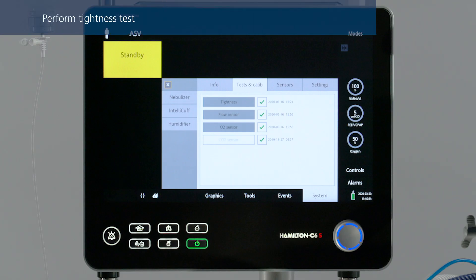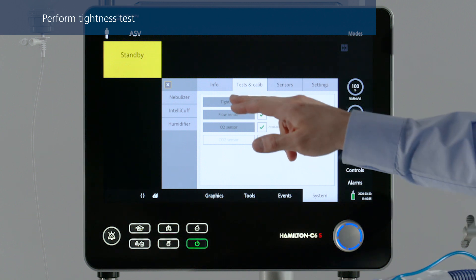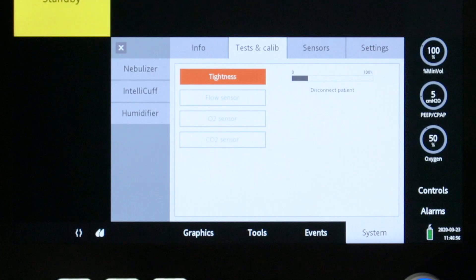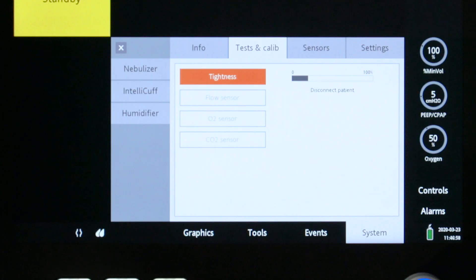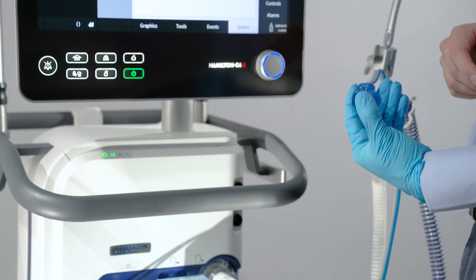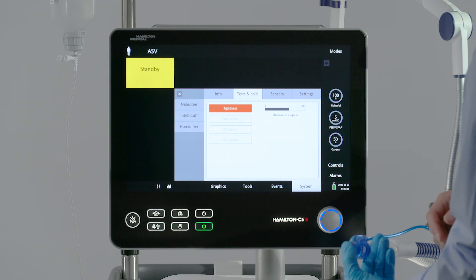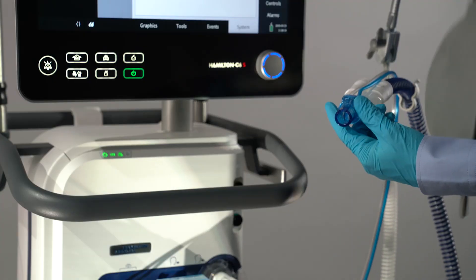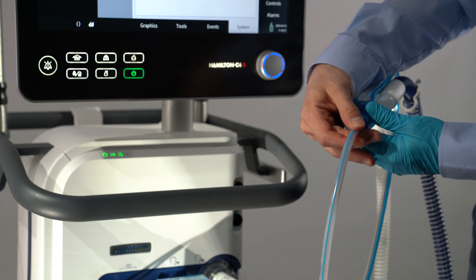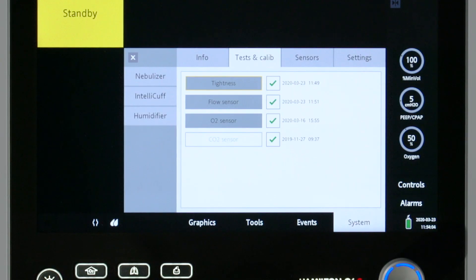The tightness test checks for leakage in the patient breathing circuit. To perform the tightness test, select the desired operation, then follow the instructions from the ventilator. Please note that wearing a glove is recommended. When the 'Disconnect Patient' message appears, disconnect the test lung. When the message 'Tighten Patient System' is displayed, block the opening. After completing the tightness test, the message 'Reconnect Breathing System' is displayed. Reconnect the breathing system. When the test has been completed successfully, a check mark will appear.